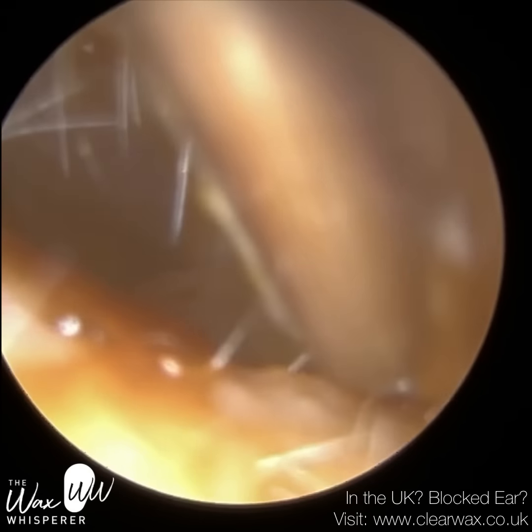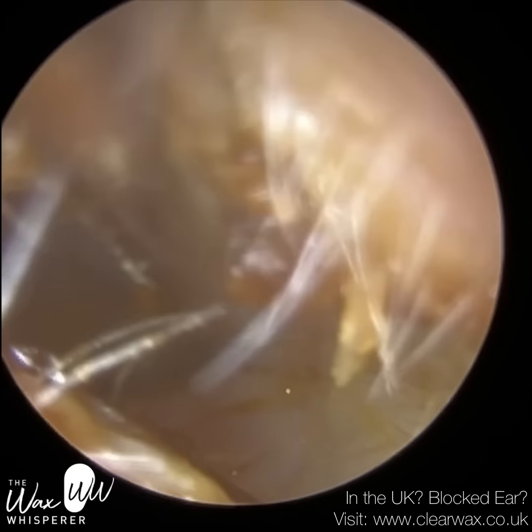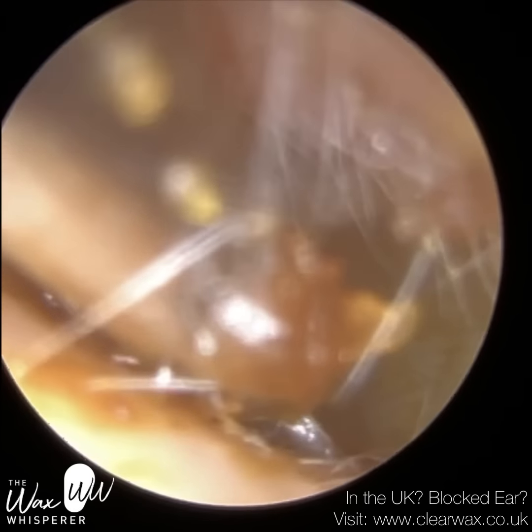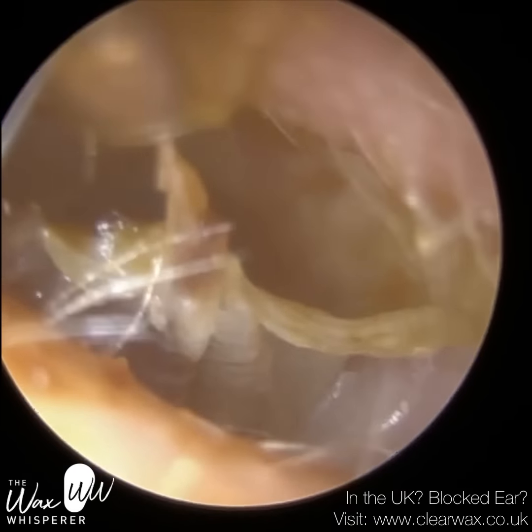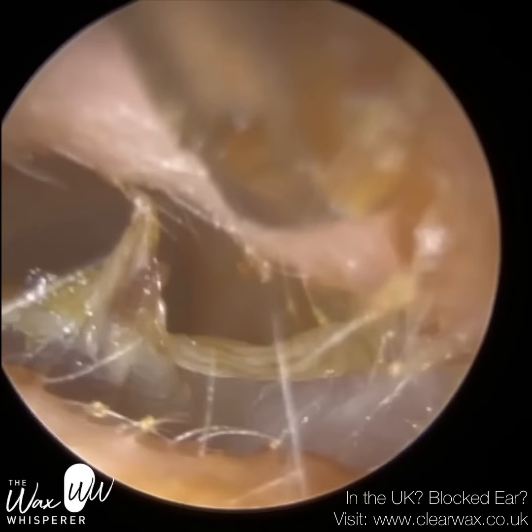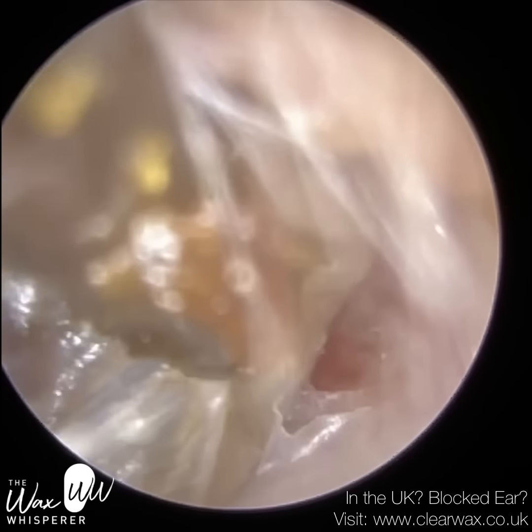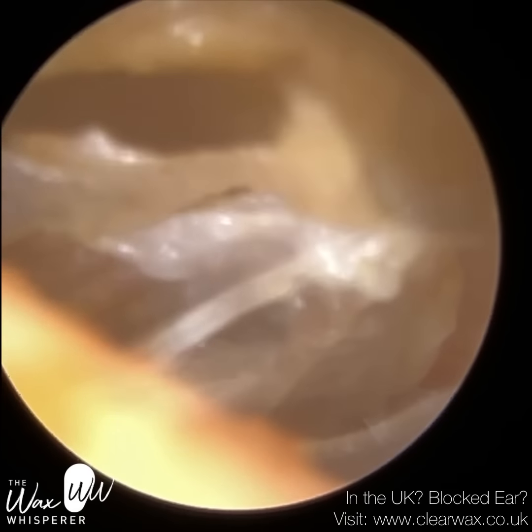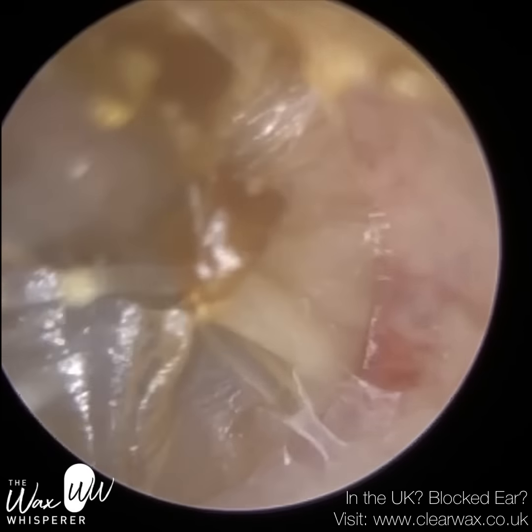There's also a dead skin layer lining the floor of the ear canal. We're going to peel this away — it's difficult to visualise at the moment, but you can see on the left side a bit of dead skin that was protruding out, and slowly but surely we're going to peel this all the way to the eardrum. You will see some blistering in the midsection of the ear canal as I peel away the skin — that can sometimes happen. Dead skin can be strongly adhered to the canal wall, and removing it can cause a little bit of blistering at the base of the canal, but it's nothing to be concerned about. The patient didn't feel it and was unaware of it.